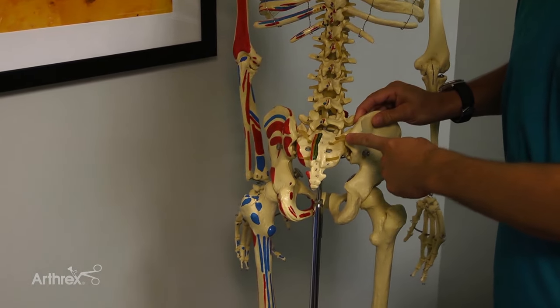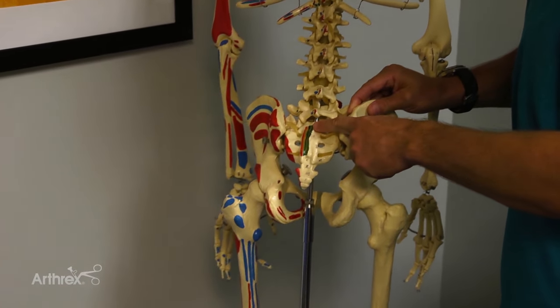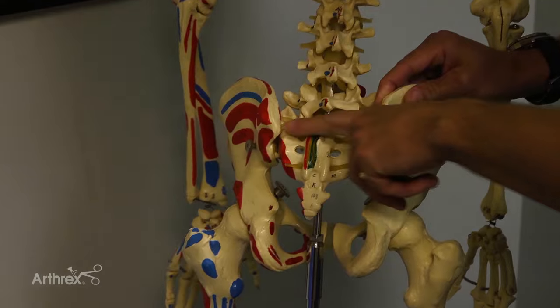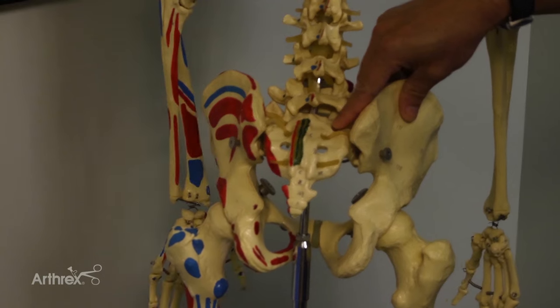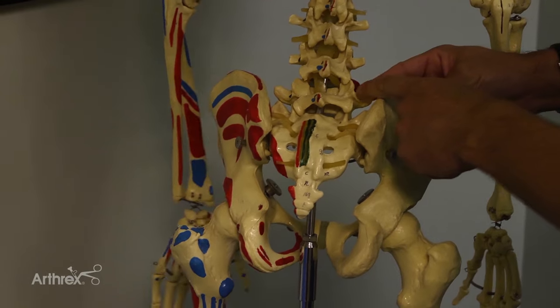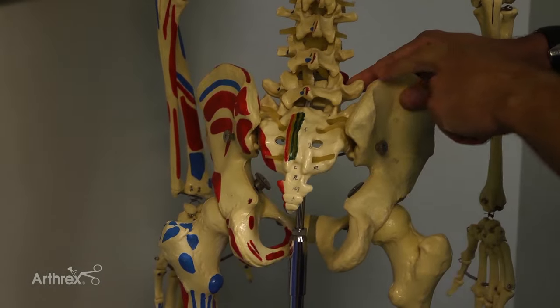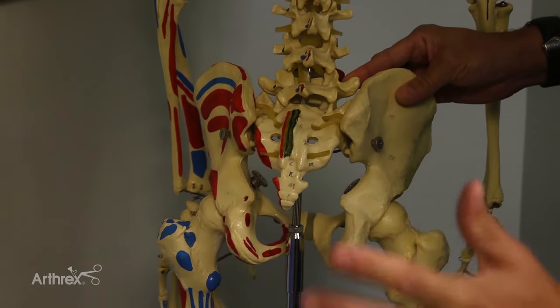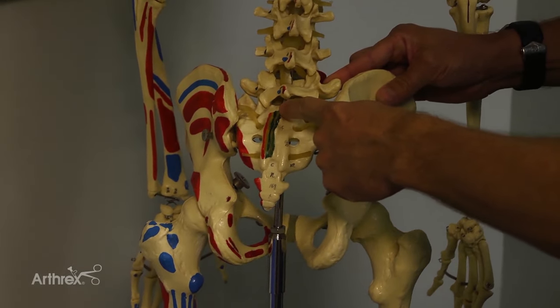The landmarks that I typically recommend using are the posterior superior iliac spine, the sacral spine, and then I always look at the transverse sacral ligament and one of these sacral foramen. If you have somebody who's really big and large, sometimes on the ultrasound you'll see the transverse processes of the spinous process at L5. When you're first starting, you really want to make sure that you line up these three sites: PSIS, sacral spine, and the foramen here in the transverse sacral ligament.